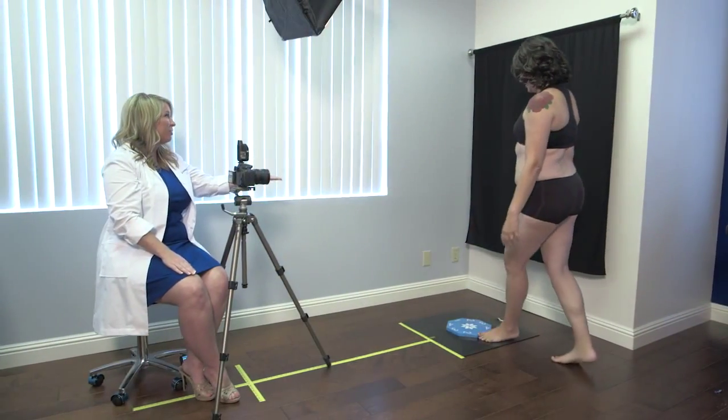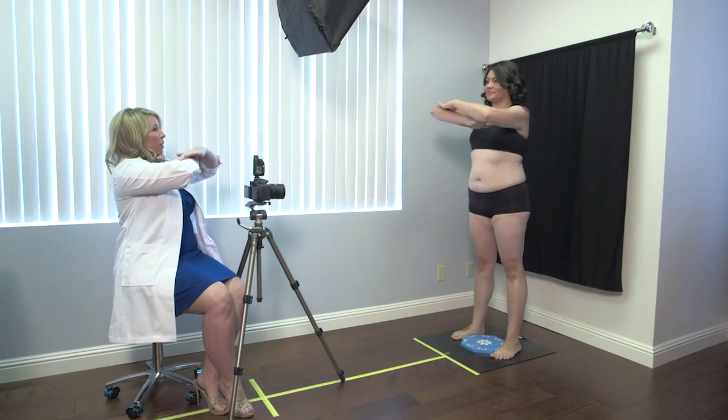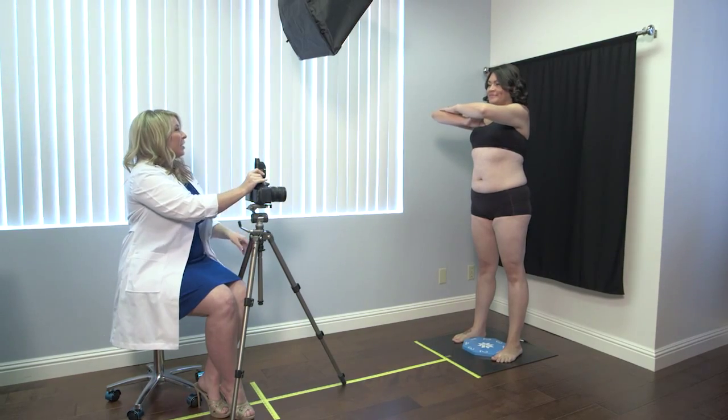On the treatment day, the patient should wear disposable underwear or bathing suit bottoms. Weigh the patient and take baseline 360-degree photos using the foot positioning guide.